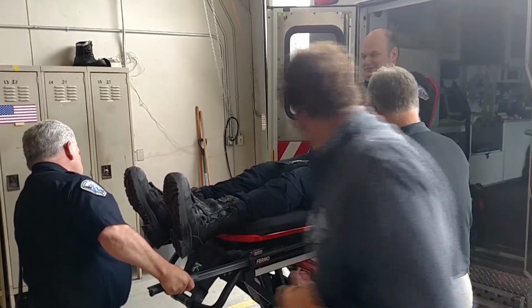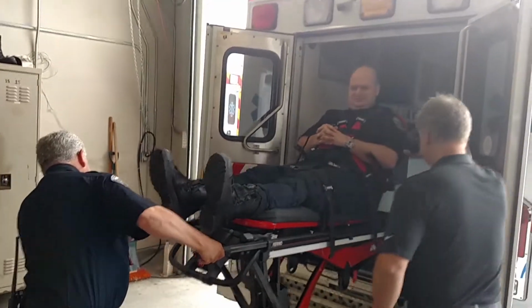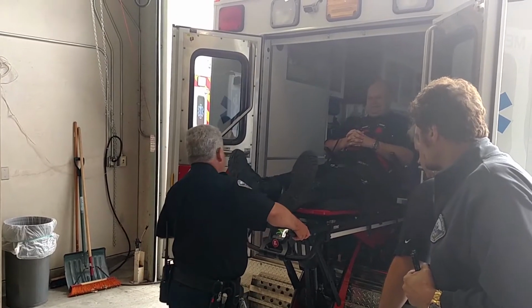Again. Okay, see that little kick up? That's what I was talking about. Gotcha. Now you've got your load wheels down.